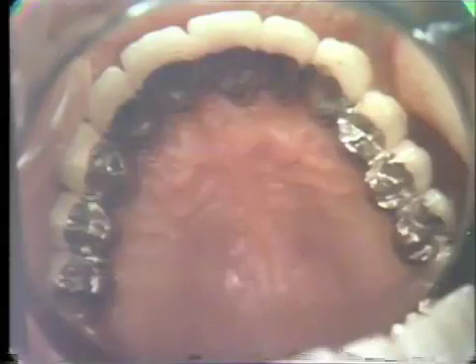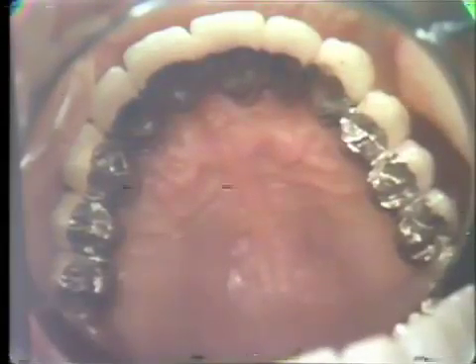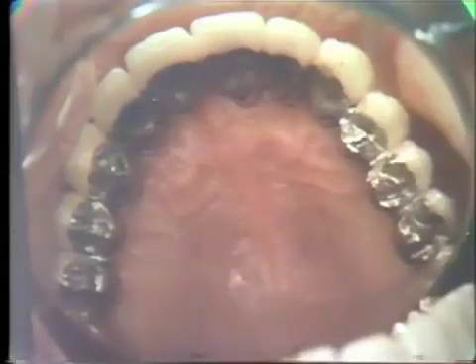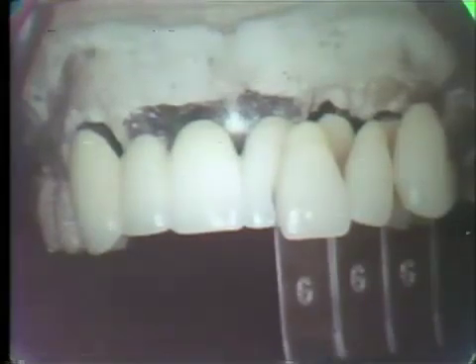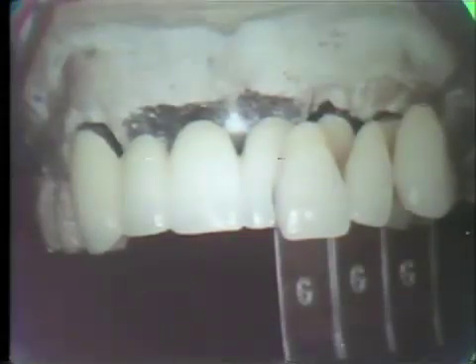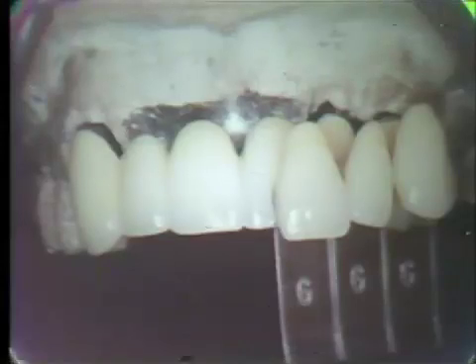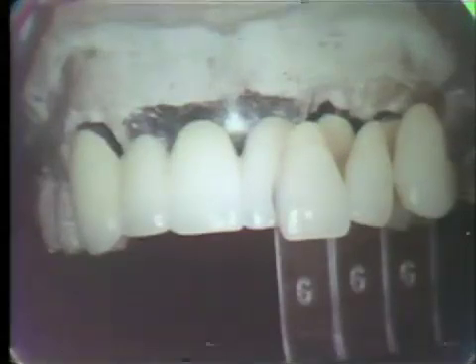If you sandblast the occlusal surface, you can pick up the movements that the mandible goes through. You can pick up areas of parafunction or bruxism. Another important area is to temporarily cement anterior bridge work with either plastic or porcelain facings to check the shade. Very often the patient would like to show the bridge to their parents, wives, or friends, and once it's cemented permanently, there is no way of removing it. If it's cemented temporarily, they can wear it home.